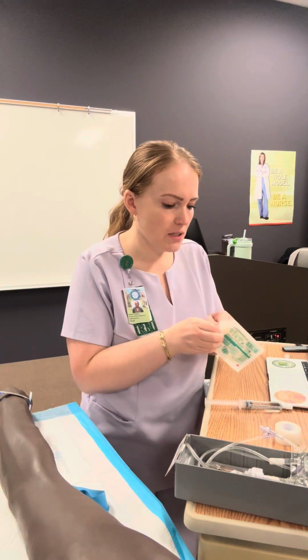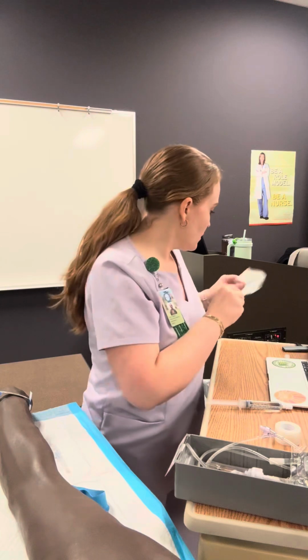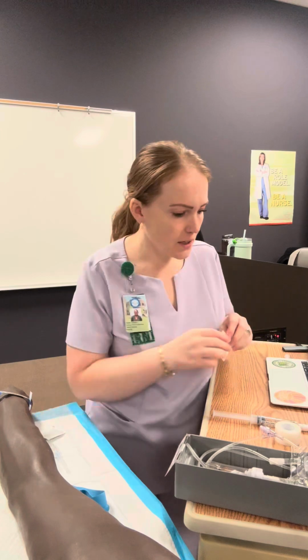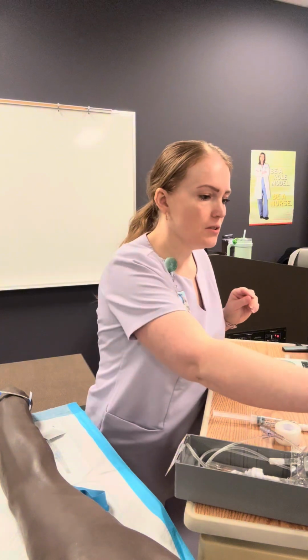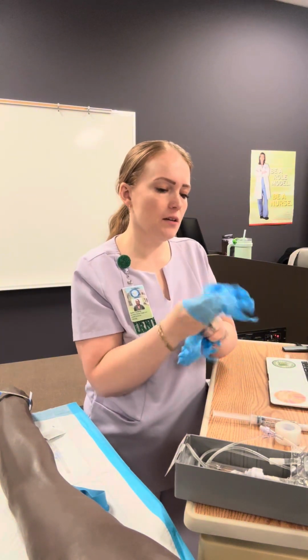I'm going to open up my Tegaderm, have that ready next to us. I have my extra flush here ready, my alcohol, my chlorhexidine ready to go, and my field is ready to go. I'll place on my gloves.